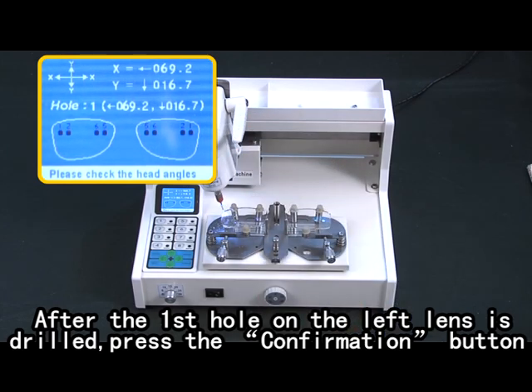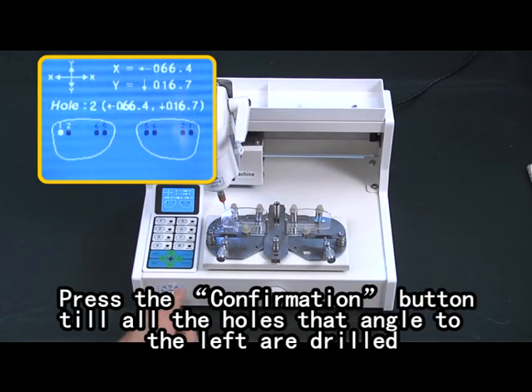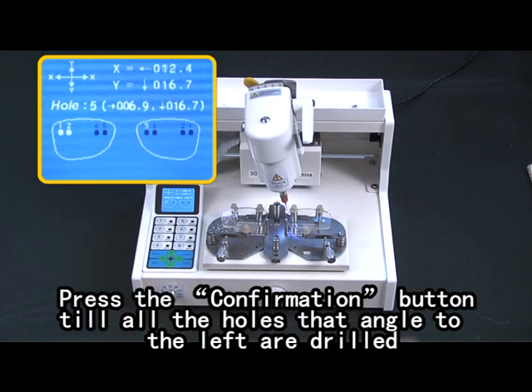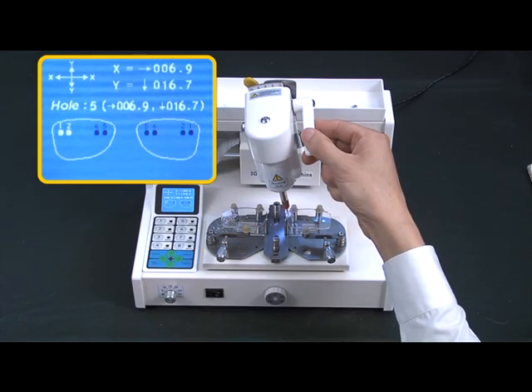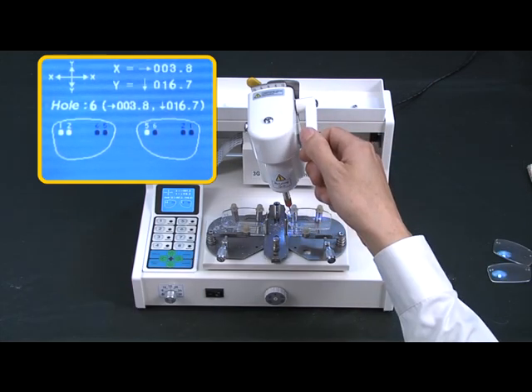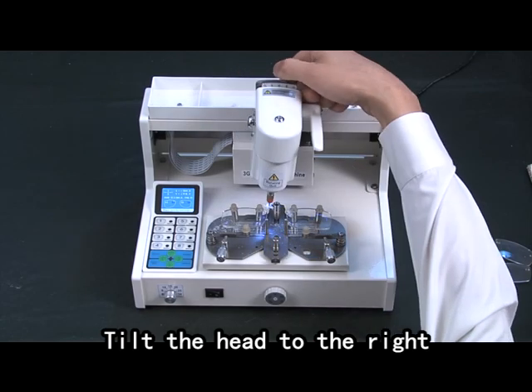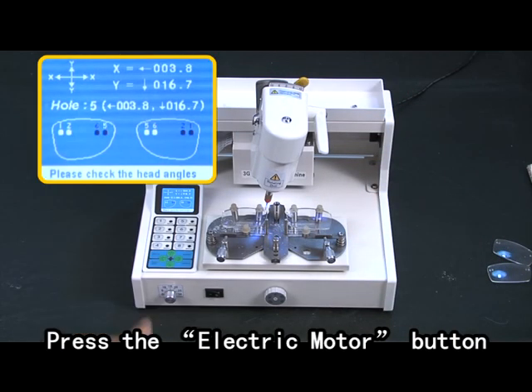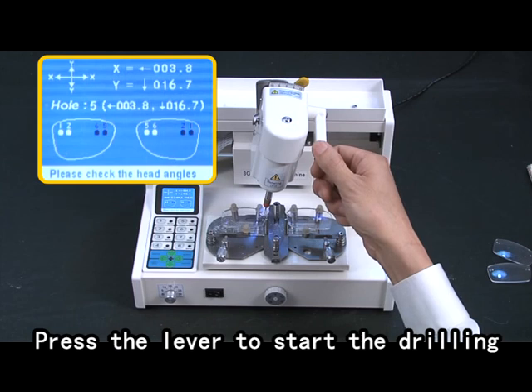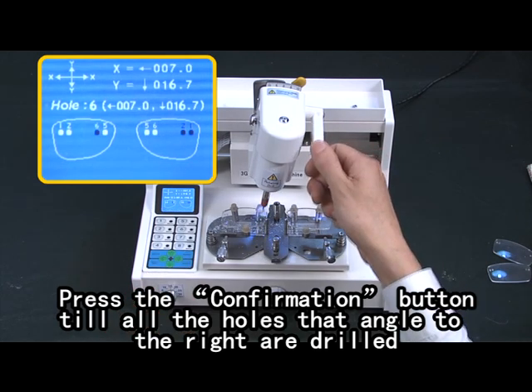Press the lever on the head to drill the first hole on the left. After the first hole on the left lens is drilled, press the confirmation button. The head moves to the second hole position on the left lens. Press the confirmation button. Drill all the holes angled to the left until complete. Tilt the head to the right. Press the electric motor button. Press the lever to start drilling. Press the confirmation button until all holes angled to the right are drilled.